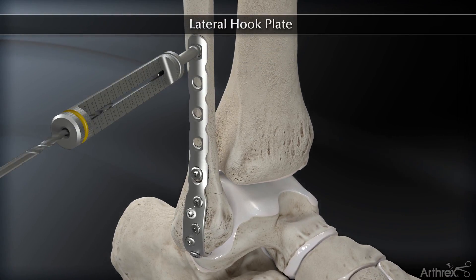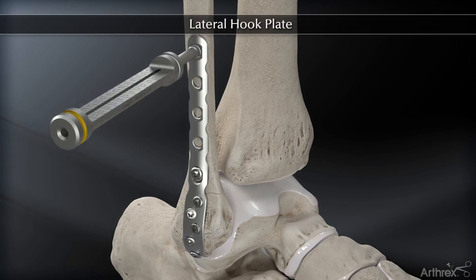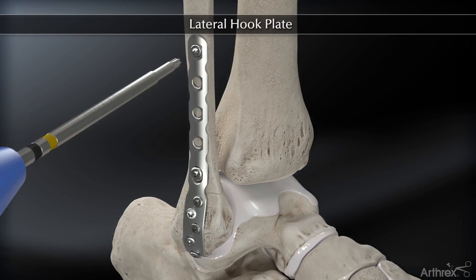Proximally, these plate holes accept 3.5 millimeter non-locking cortical screws, 3.5 millimeter locking screws, and 4.0 millimeter cancellous screws, as deemed necessary by the surgeon and bone quality.